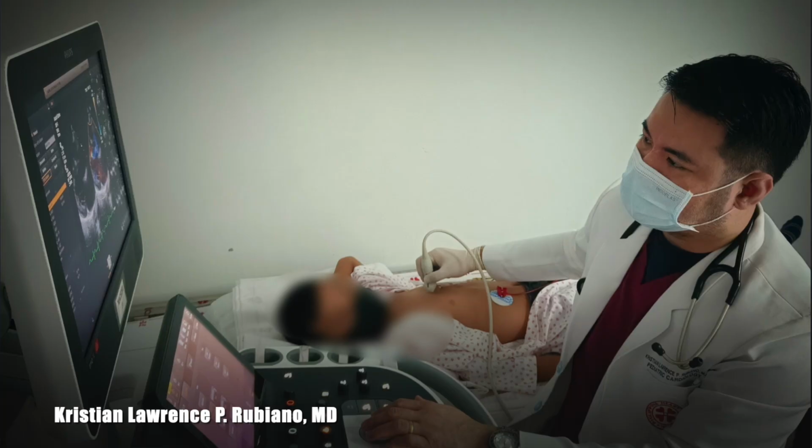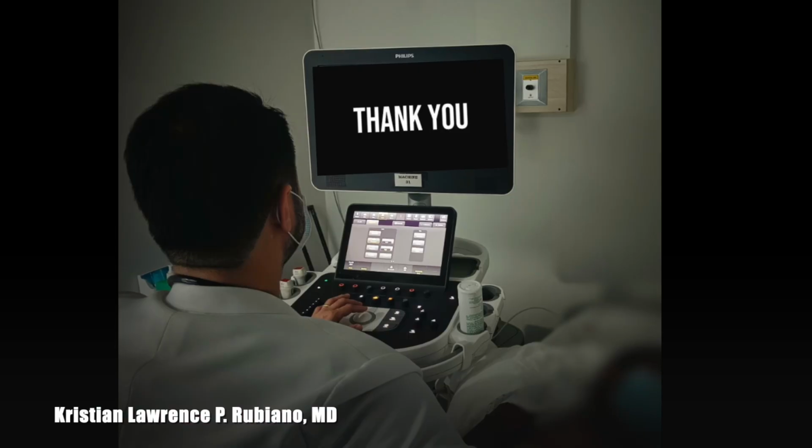In general, you can devise your own strategy in doing 2D echocardiogram. Suffice for me to say that we need to be systematic in doing the procedure, whether we start with a subcostal view or parasternal long axis view, depending on which is feasible. You can create your own style in performing the echo as long as you arrive at a diagnosis that will best manage your patient.